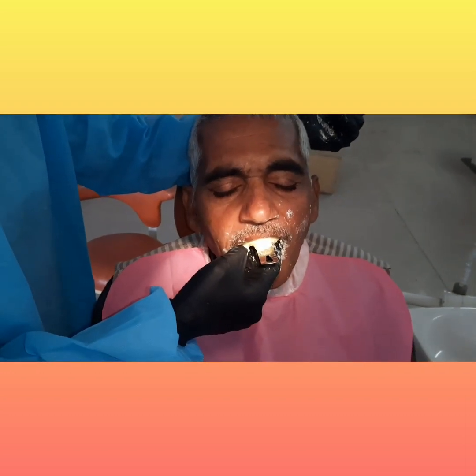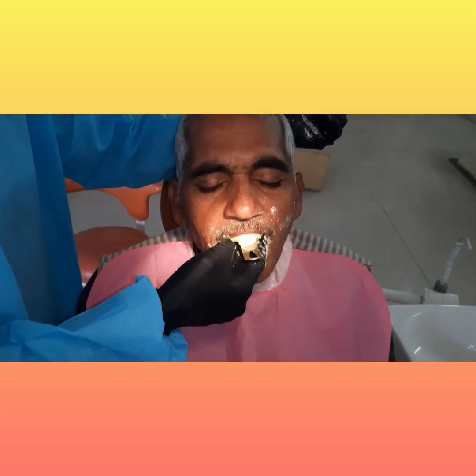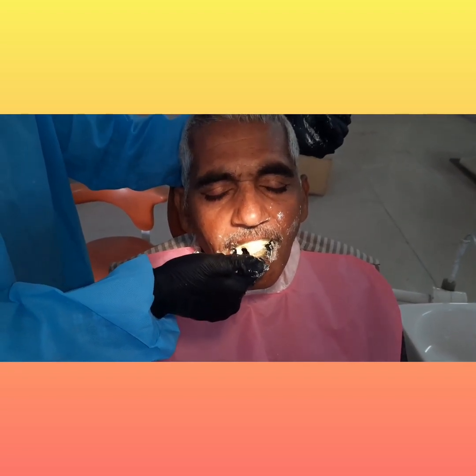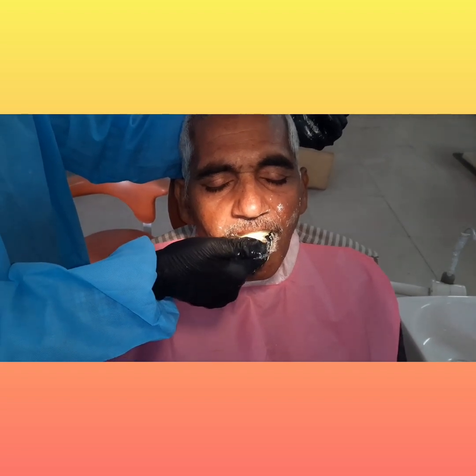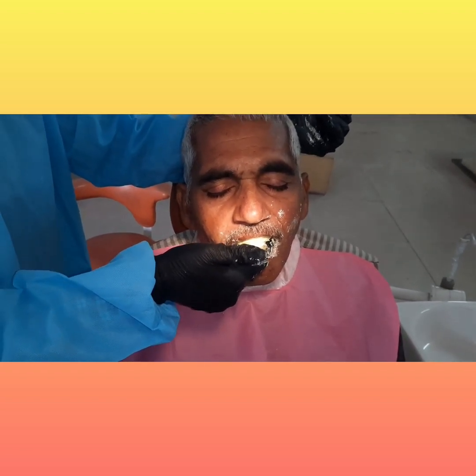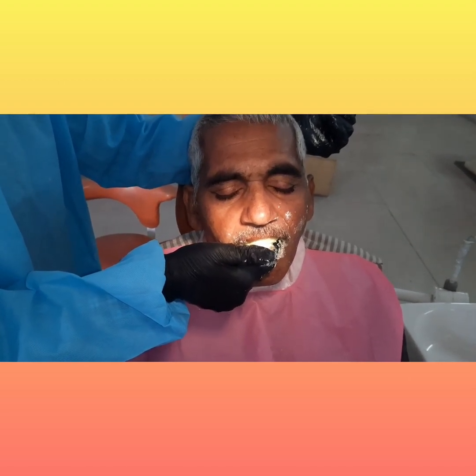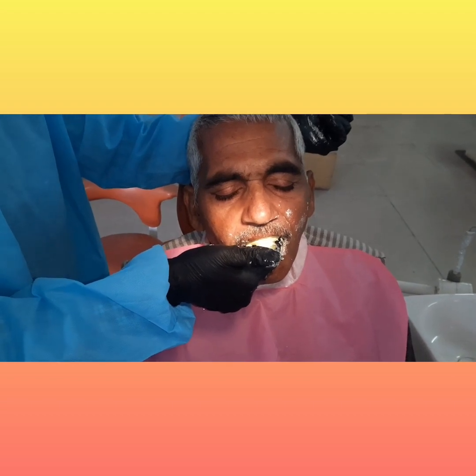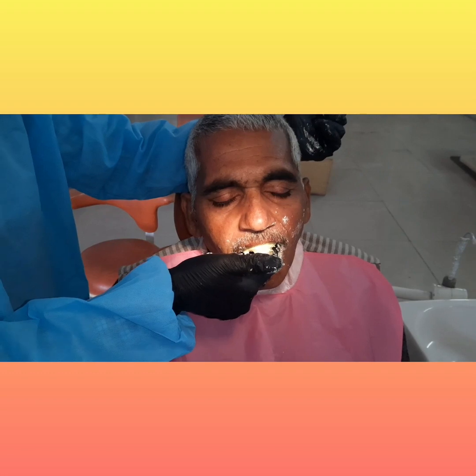Alginate is an elastic, irreversible hydrocolloid material. It can be used where you have undercuts, although in very severe undercuts it should be avoided because it has poor tear strength and there are chances of tearing. In moderate undercut areas, alginate can still be used as it is an elastic impression material.